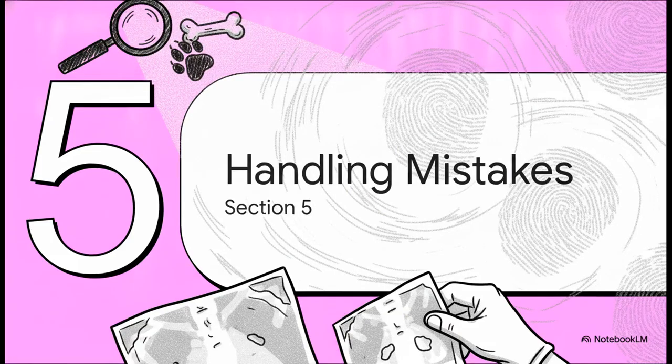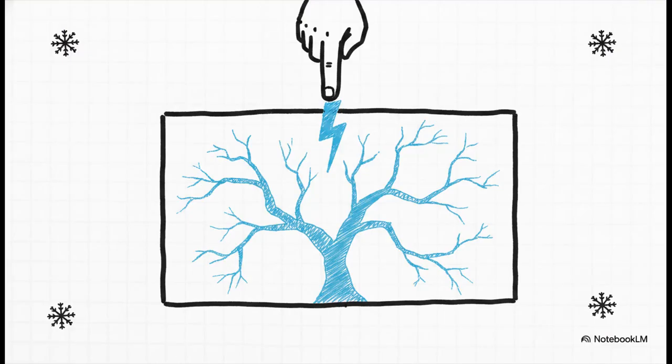And finally, Section 5, Handling and Setup Mistakes. Let's wrap up our detective work with the physical handling of the film itself. Believe it or not, static electricity is a huge enemy here. When you mishandle the film, electrons can pass right onto it, and they literally expose the film without a single X-ray ever being fired. It creates these distinct black marks that look like smudges, or even these crazy dramatic lightning strike tree patterns right across the image. It's an incredibly common issue, especially if you're working in a cold, dry climate.